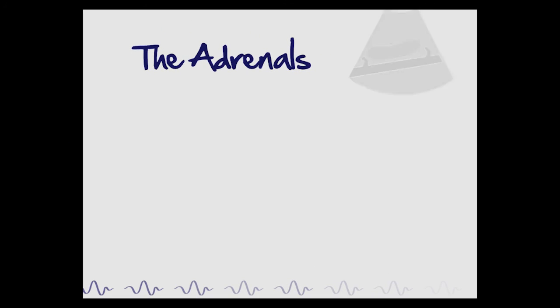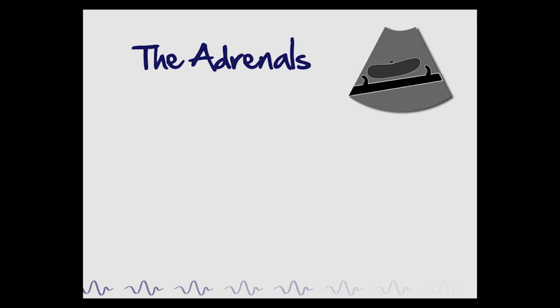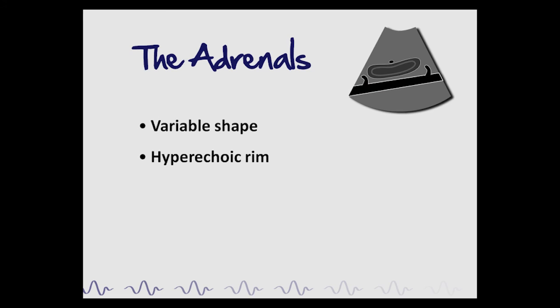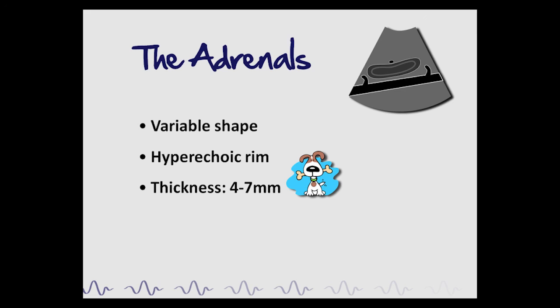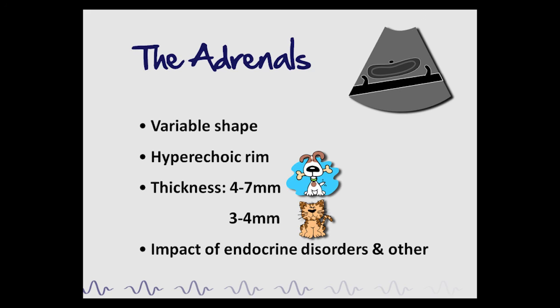As seen in the previous ultrasound loops, the shape of the adrenal glands varies according to the side and image plane used. It can also vary in shape among animals — for example, it is flatter in large dogs and more rounded in small dogs, and even more rounded in cats. Additionally, a thin hyperechoic rim may be present at the junction between the medulla and cortex in normal dogs. Measurement of its dorsoventral thickness is most representative of its size. Normal adrenal glands vary between 4 and 7 mm in dogs and between 3 and 4 mm in cats. The impact of the different types of endocrine and other disorders on the adrenals must be understood when examining these glands and interpreting their size.